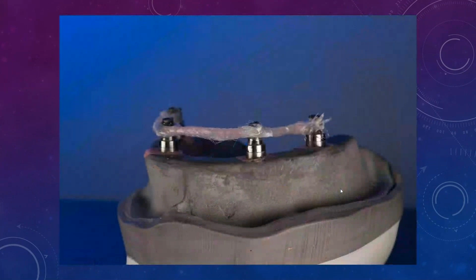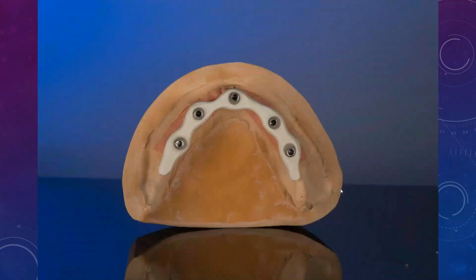And from here, you can reinforce your hybrid, temporary hybrid, a couple of different ways, guys. One of them is to use this fiber force rope. The method that I personally like to use is using, what's the name of this stuff? My goodness, I can't believe it just escaped my mind. It's called Trilor. There we go. Trilor. It's sold by Harvest, I think. In Canada, I think it's sold by Swiss NF, and it works really well.